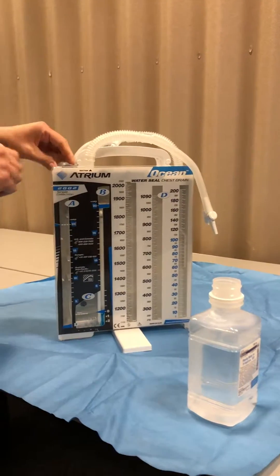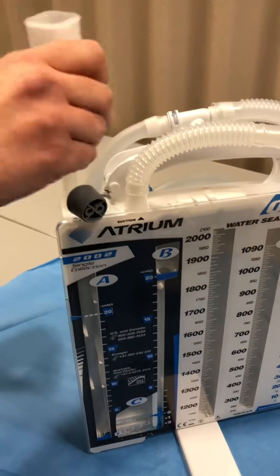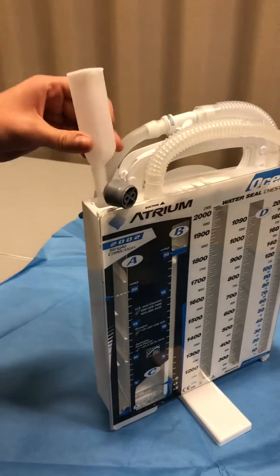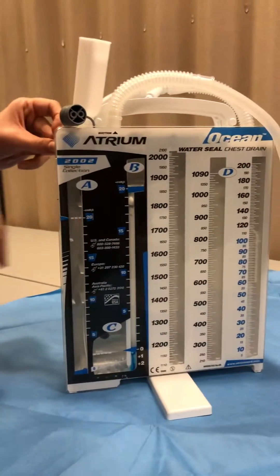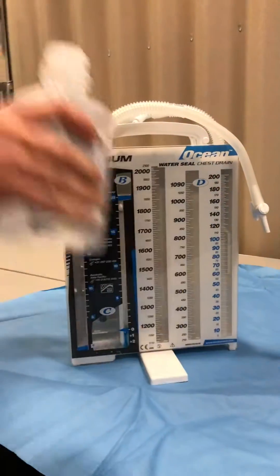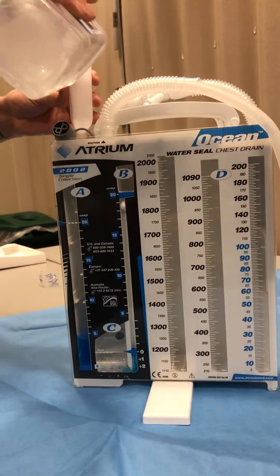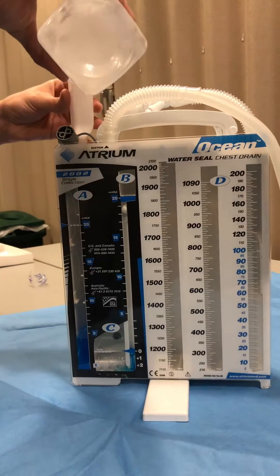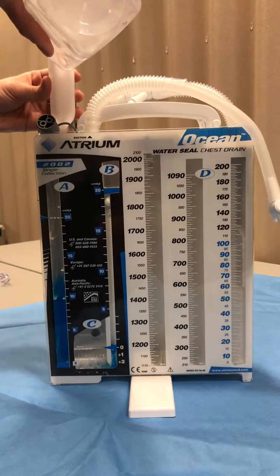Now right here, you just remove this little rubber piece and we can put this in. We're going to fill the suction control chamber to the 20 centimeter mark. With this one, you're just going to fill, check, and see where you're at. The water turns blue so that it's easier to see.